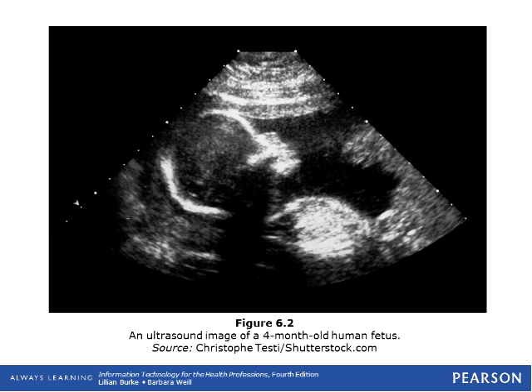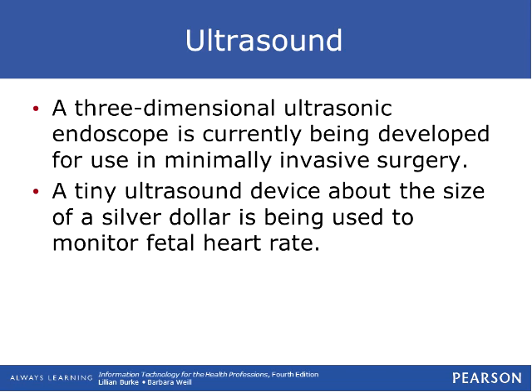This is an ultrasound of a baby. You can see the baby's head right here. The baby's head right here. There's the body of the baby, and so you can see this is a very old ultrasound. By the way, nowadays they're in 3D and in color, so this is a pretty old ultrasound.